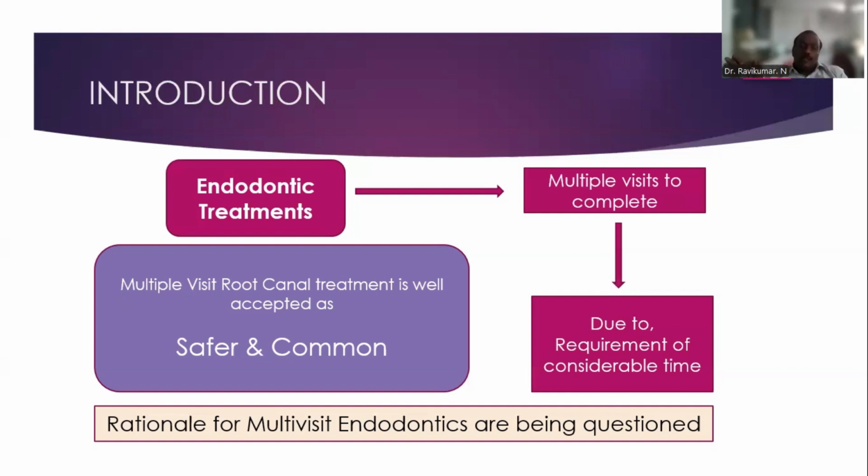The patient is not able to come for a longer period, or the patient wants to complete the treatment in a single visit. Also, in the case of a mentally challenged patient, those are the patients we can finish in a particular time. This is called single visit. All this procedure, locating the canal or access cavity preparation followed by biomechanical preparation and the obturation.